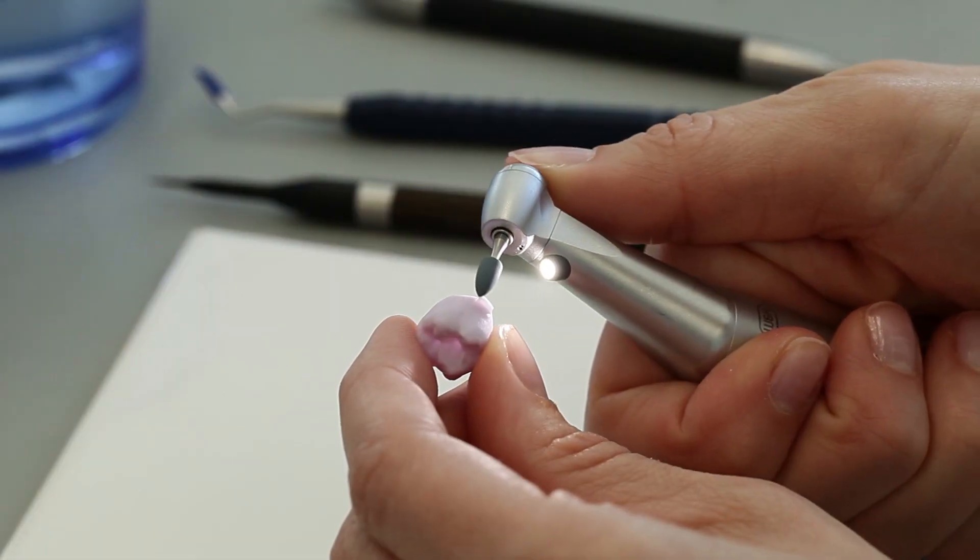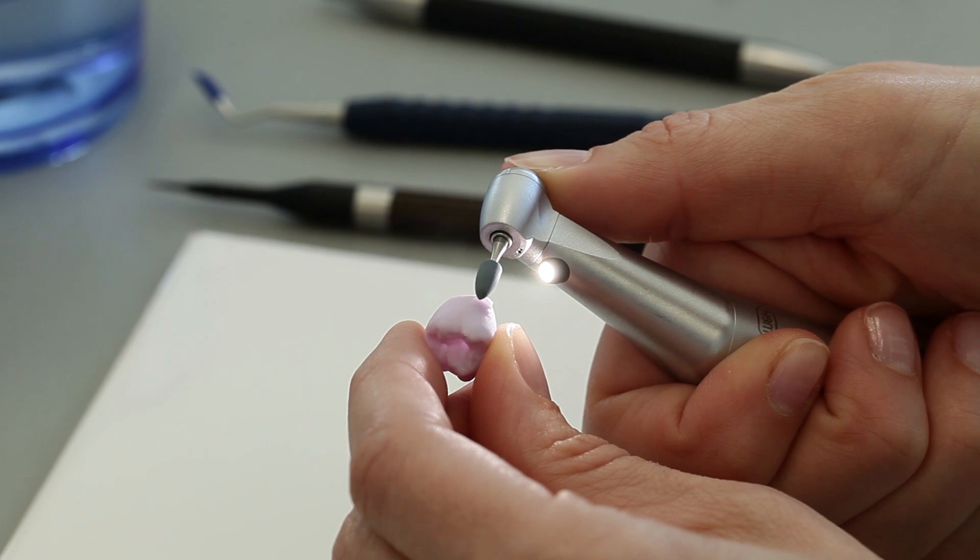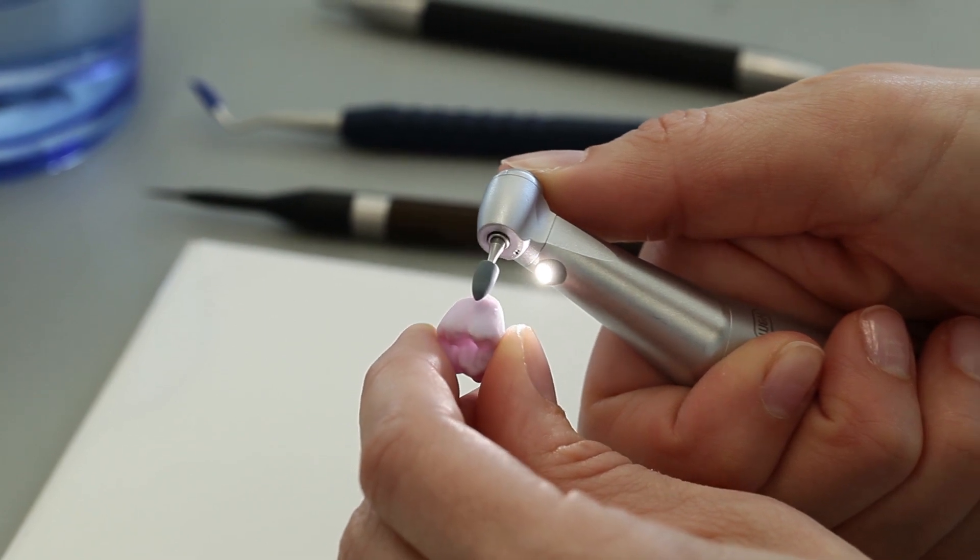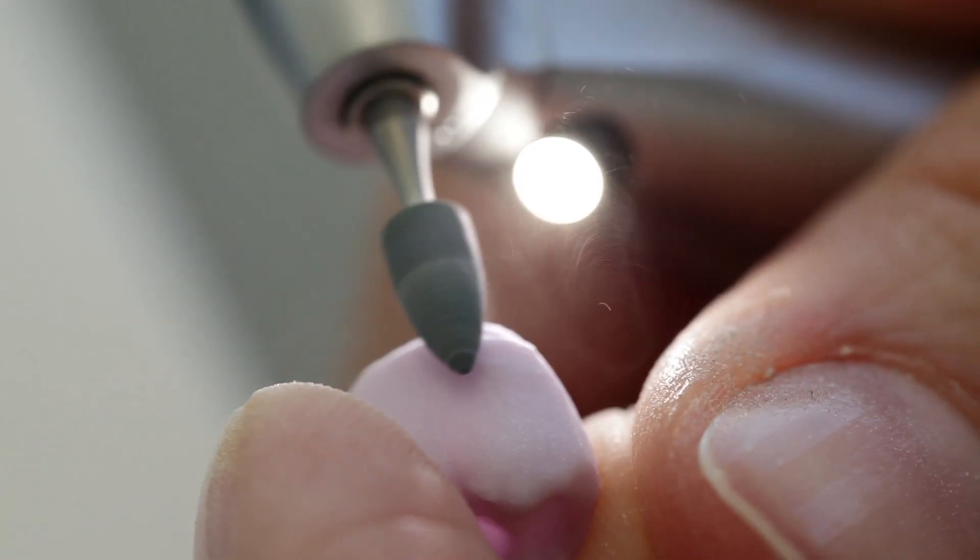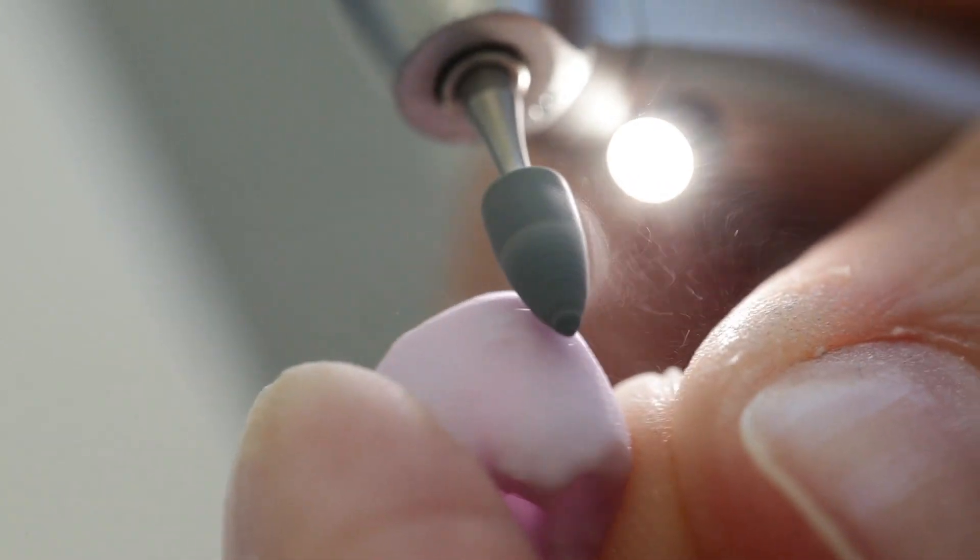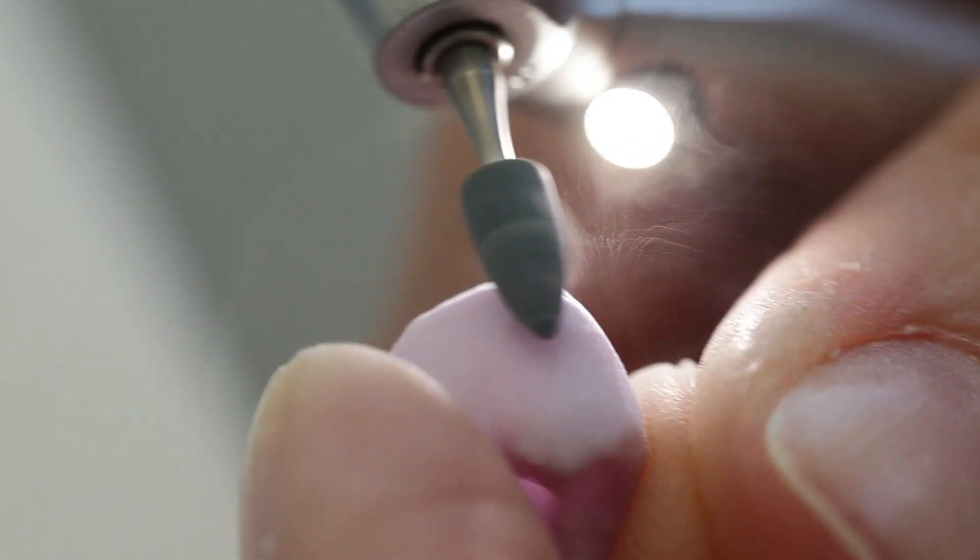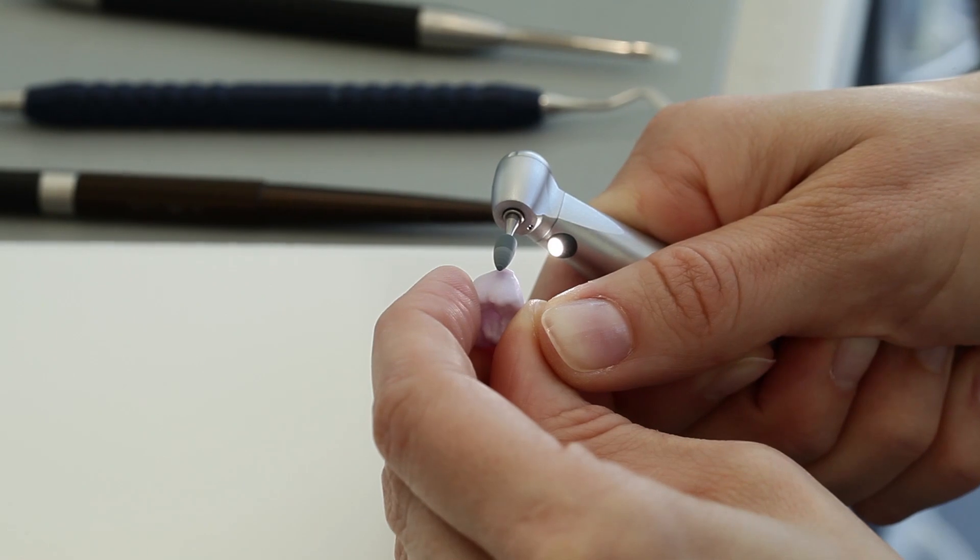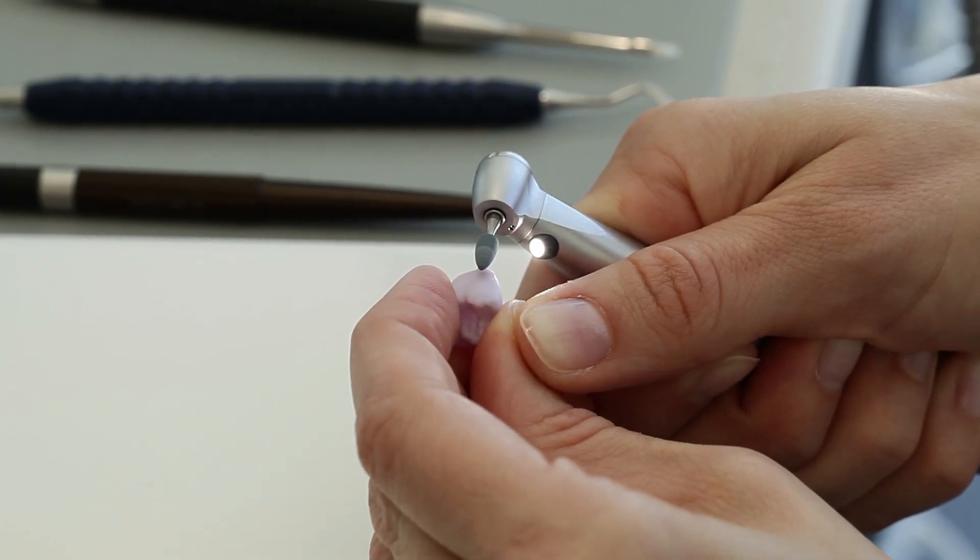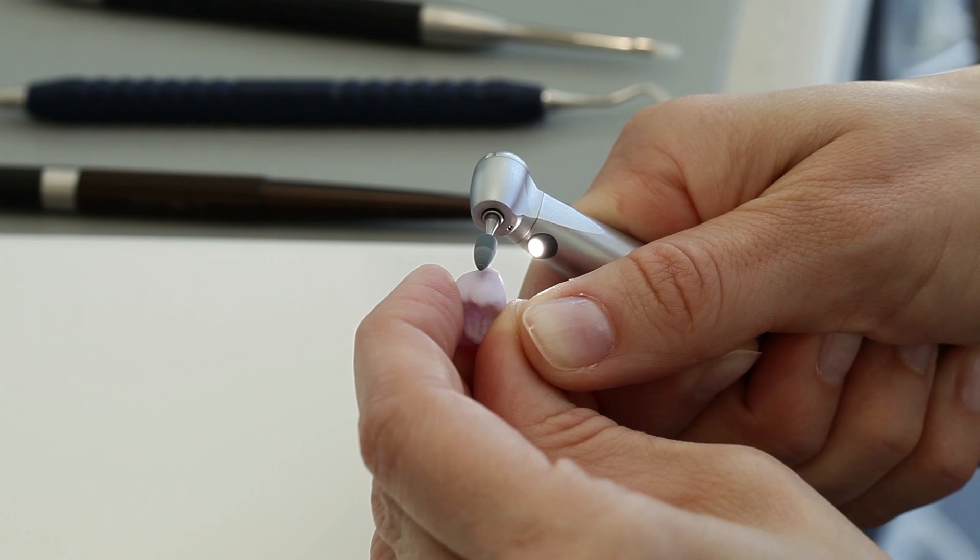Hold the milled IPS Emax CAD restoration and grind down the attachment point. Consult the flowchart entitled Recommended Grinding Tools for Glass Ceramics to select the most appropriate grinding instrument. Use low RPMs and light pressure to grind the attachment point.